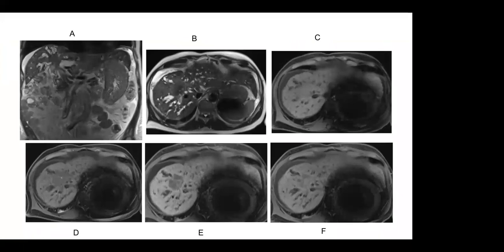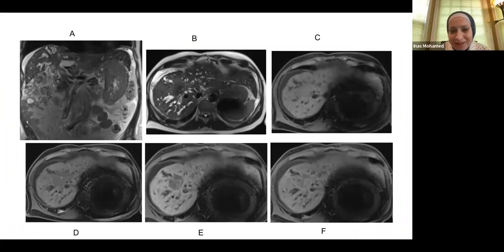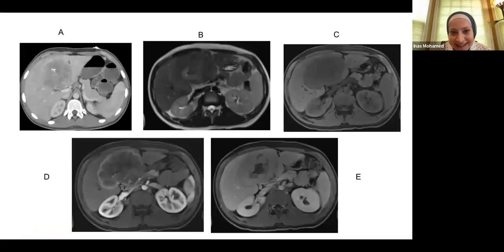Excuse me. One question from the chat box. Someone is asking why not giant hemangioma? Oh, why not giant hemangioma? Okay, let's go back.